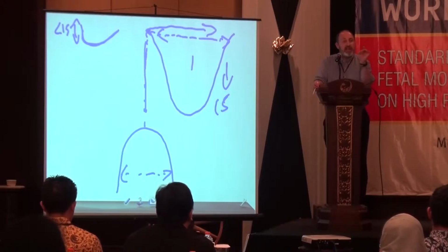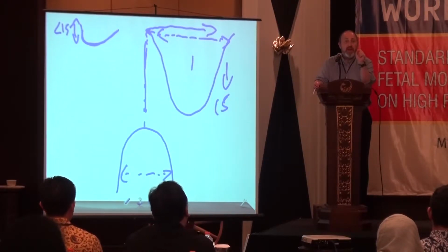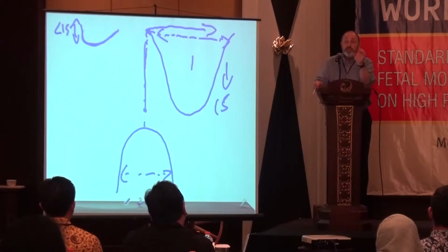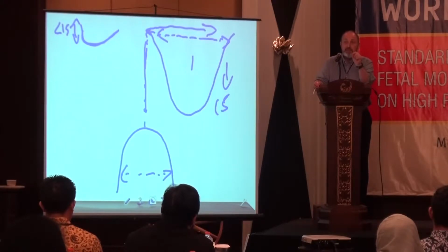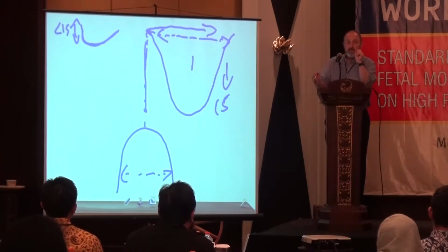Late decelerations are associated with hypoxia, with acidosis and a low Apgar score. So they are associated with adverse outcomes. However, and you know this from your clinical practice, most infants who display late decelerations will not be compromised, truly. But they are at a much greater risk of being compromised than infants who don't have decelerations at all or who have early decelerations. Would you agree with that?